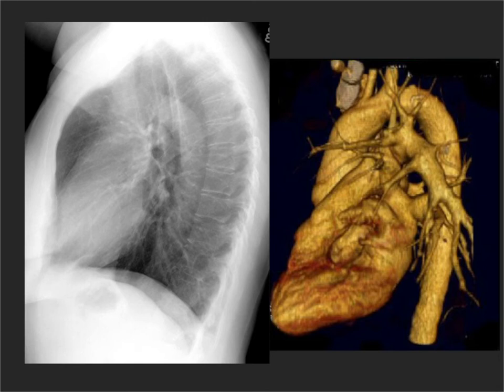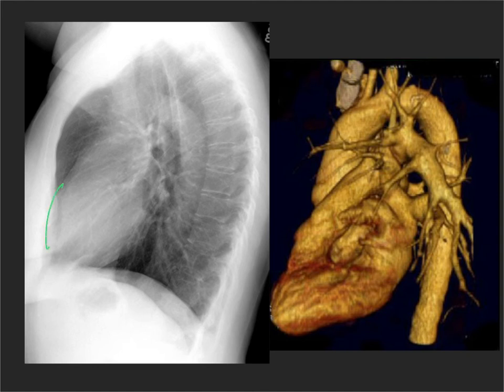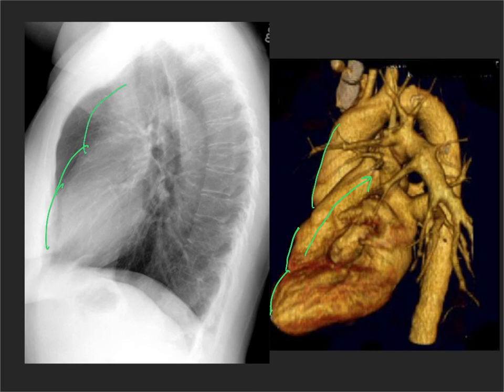Now I want to show you that cardiac and vascular anatomy alongside a maximum intensity projection of an aortic angiogram done by CT, where we've stripped away everything apart from the contrast, so we're only seeing the vascular anatomy and the insides of the ventricles. So going over it again: right ventricle, pulmonary outflow tract going into the main pulmonary artery, ascending aorta, aortic arch, and the left main pulmonary artery coming across. The right pulmonary artery we won't see because that's on the other side of the patient's heart.